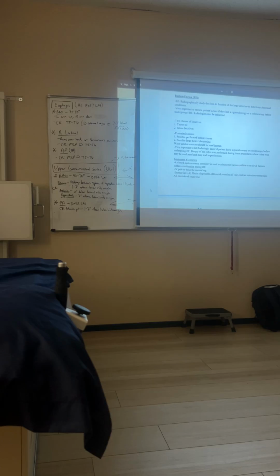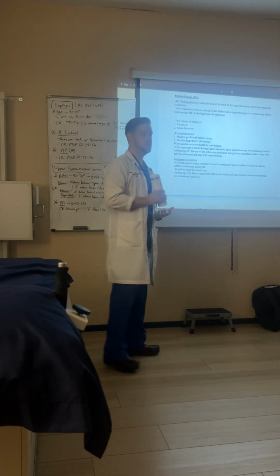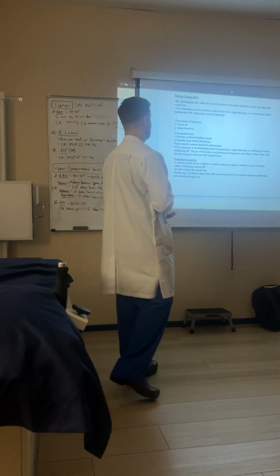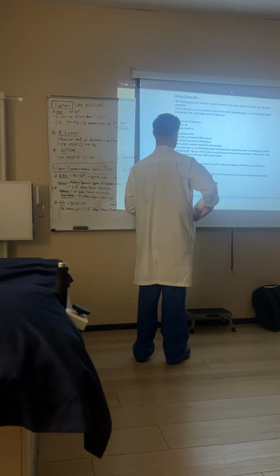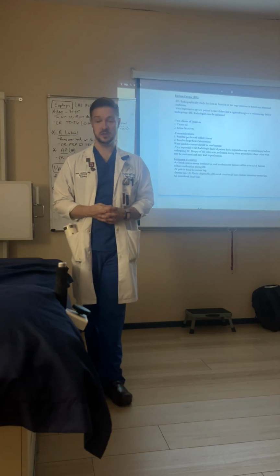Fun. So the barium enema, also called the BE, is the study that we use to radiographically evaluate the large intestine, okay? We study the form and function of the large intestine, basically to detect any abnormal conditions. We do this often.